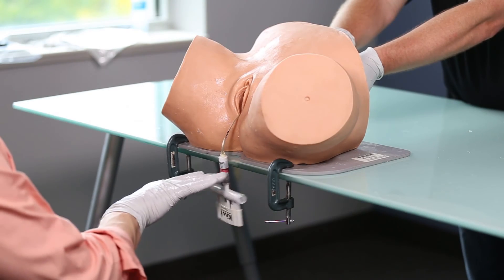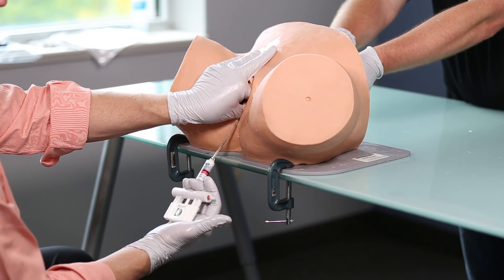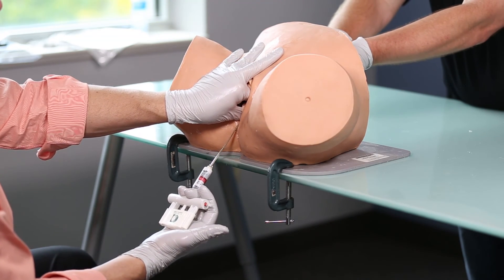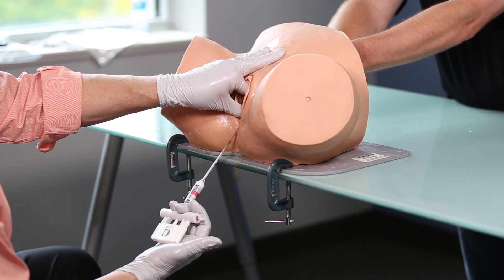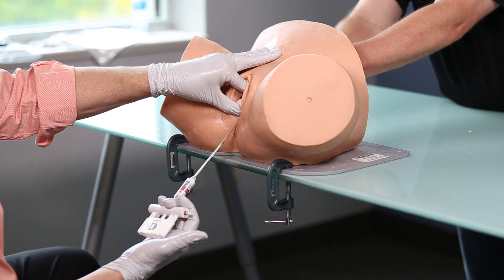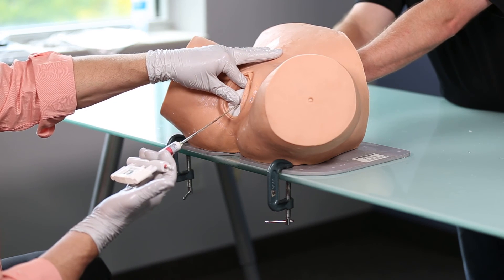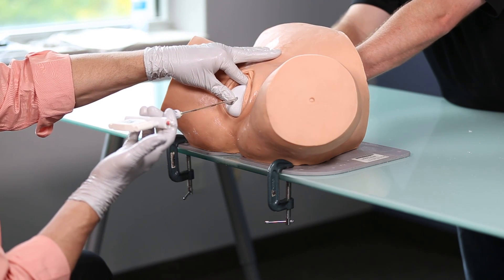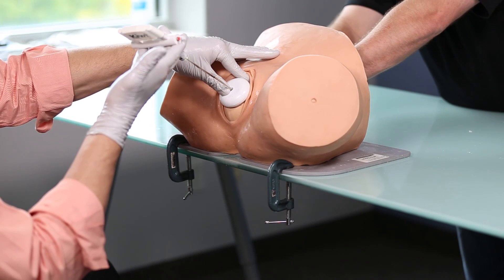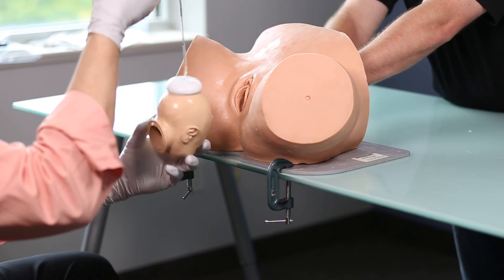Step number five is to place the thumb on the cup and the index finger on the baby's head to prevent the cup from coming off and to provide counter traction during our pulling efforts. As mom begins to push, we provide traction in a downward angle — in this baby who is right occipital posterior. As the baby gets further down in the pelvis, notice the direction of pull changes, until I finish here as the baby reaches the perineum, and you can see where the cup was placed.